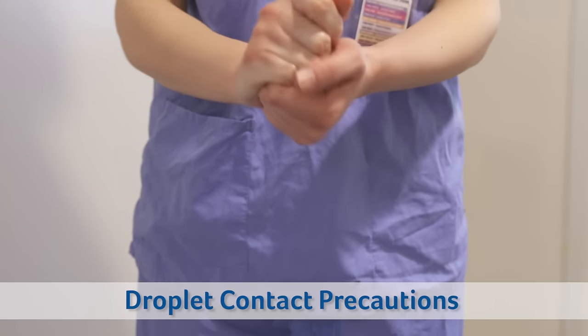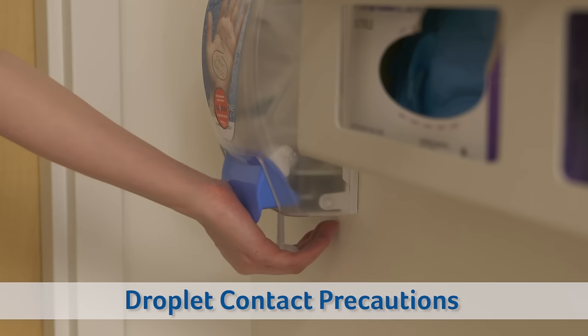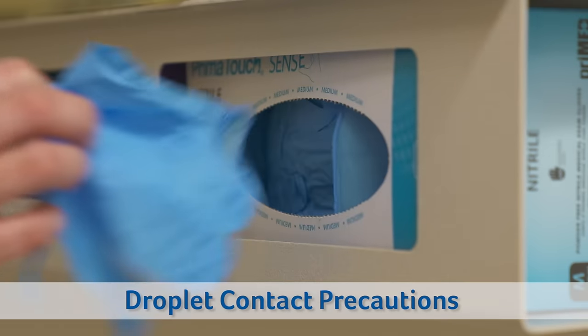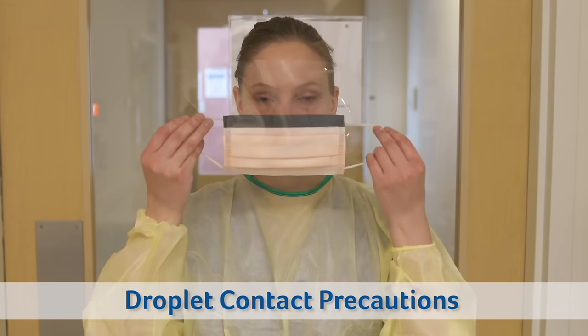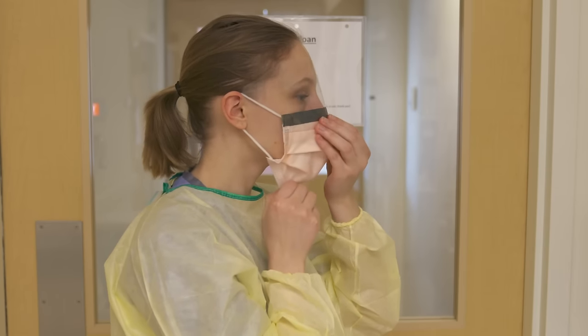For droplet contact precautions, a procedure mask is required. Follow the same donning procedure for hand hygiene, gowning, and glove placement. For the procedure mask, place elastics around ears, form to the bridge of the nose, and pull under the chin.